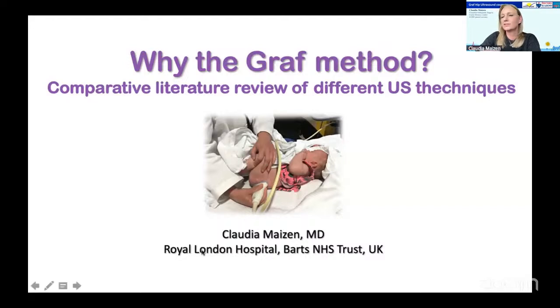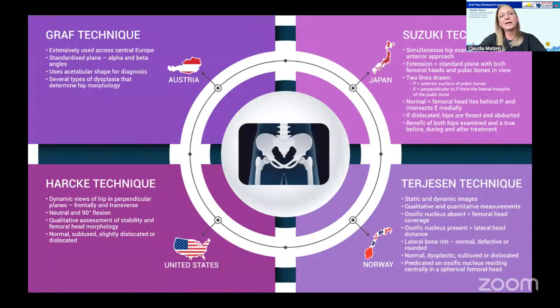I'm going to try not to convince you, but to put it out there and compare what has been published in the literature. In our literature review, we concentrated just on the most widely used ultrasound techniques: the Graf technique, the Suzuki technique, the Harcke technique, and the Terjesen technique or Morin technique.